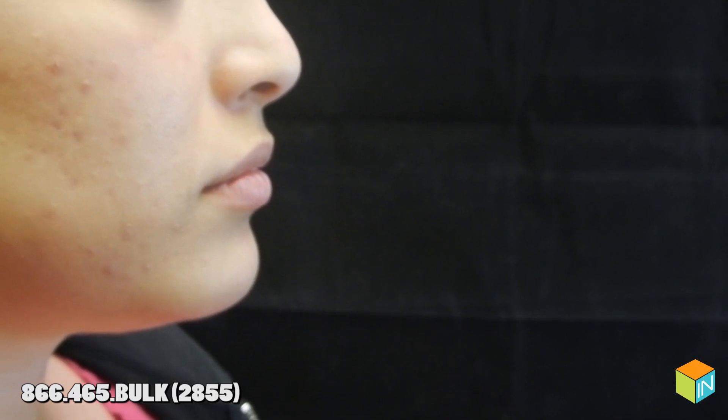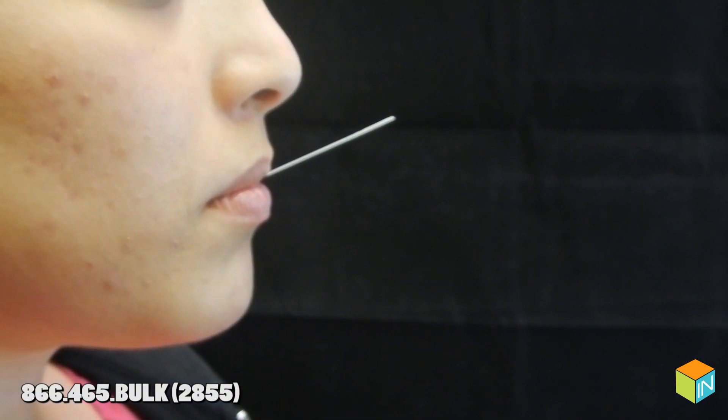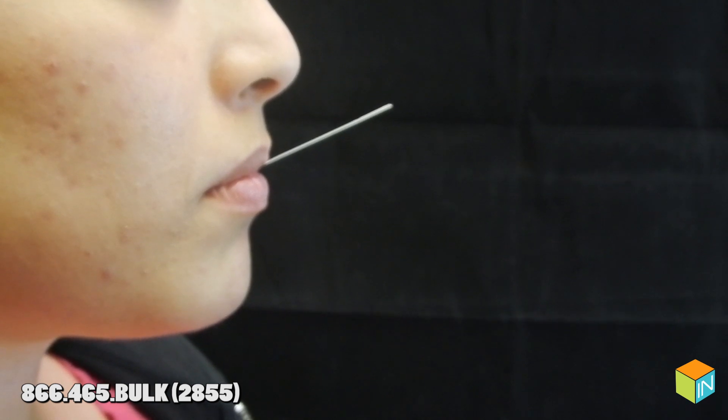The testing procedure, Step 1: Wet the test pad with saliva for 5 seconds, then remove. Start the timer immediately.